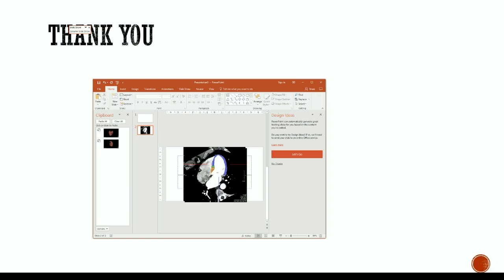If you've got a towel and you're twisting one way on one end of the towel and the other way on the other end, and you're measuring the ends, it's clearly different, and you measure the middle and it's somewhat conflictual. Then as you move from the middle towards the right hand, which is twisting clockwise, and from the middle to the left hand, which is twisting counterclockwise, you're certainly getting confounding information. Does that make sense? Oh, yes, it does.